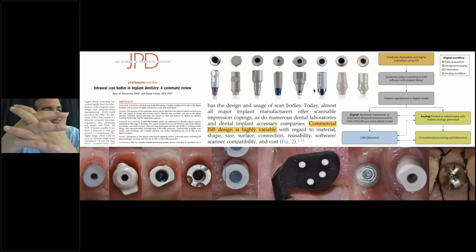And this is important for you to understand, because a scan body gives the information not only of the implant position. So you're not sharing only the implant position with your lab technician, but you're also sharing the titanium base to utilize. And if you want to produce a model, like in the anterior areas, and you will see in a while, you need to have a digital implant analog.